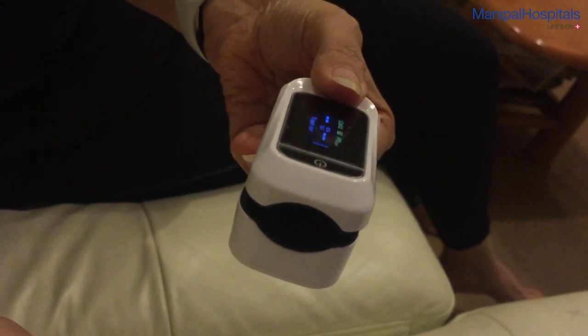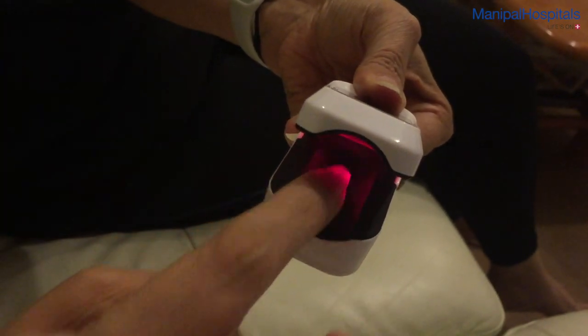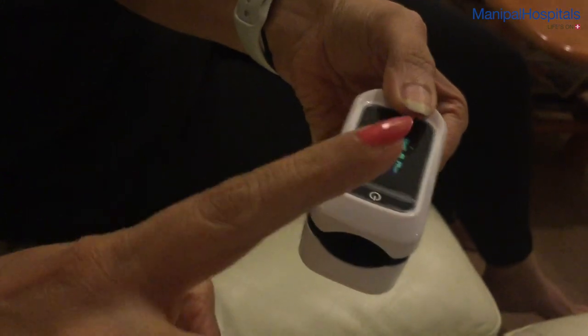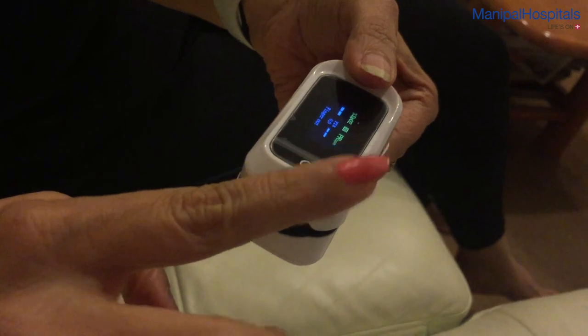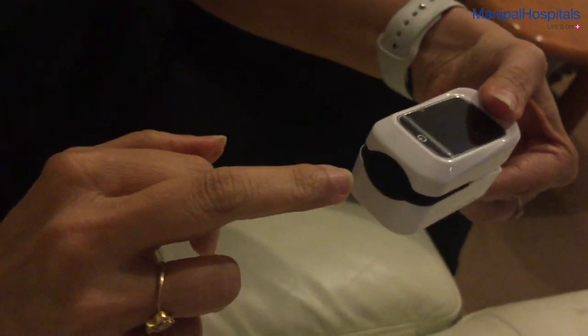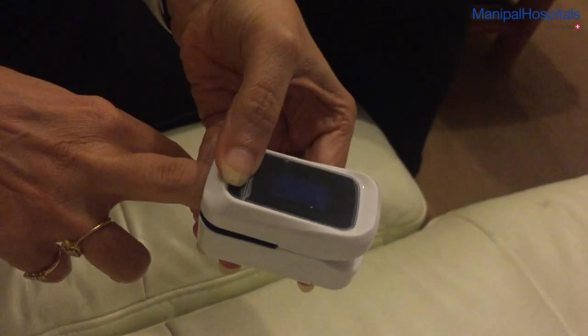It opens like a clip. You turn on the machine and there is the LED sensor. The finger is inserted into the sensor — that's the wrong finger to insert because it has nail paint on it and a longer nail. You should insert a finger without nail paint and with a shorter nail.